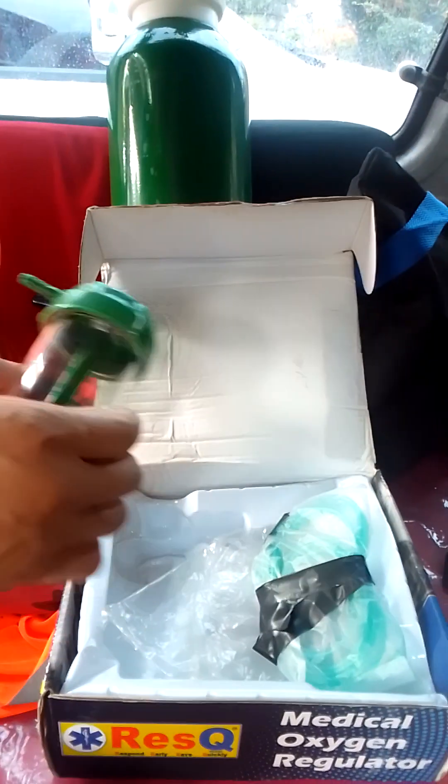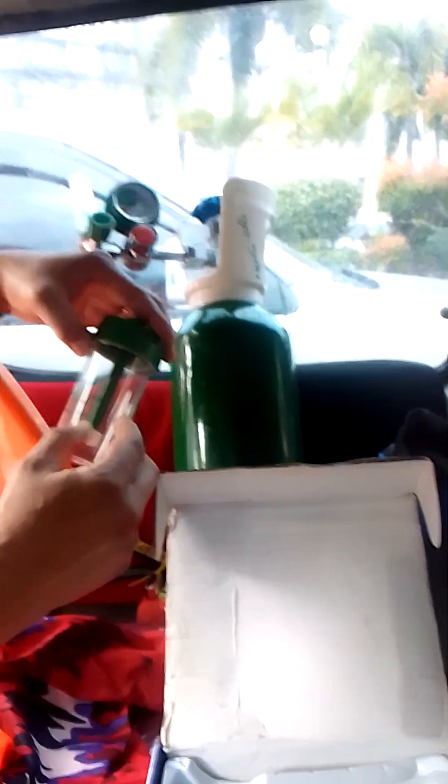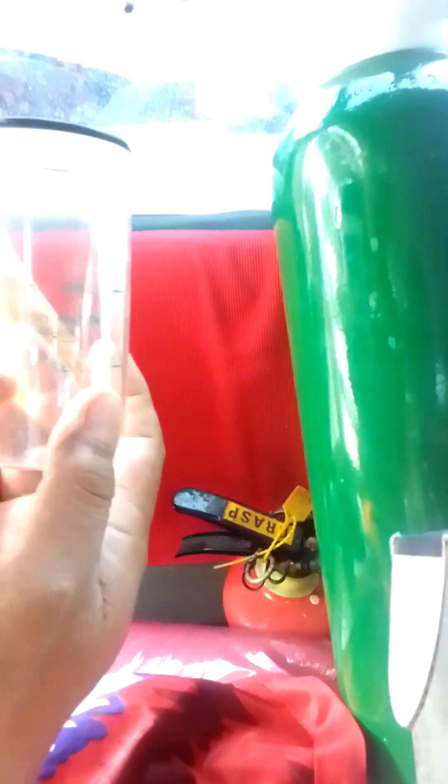First thing is you have water — spring water, not water from the sink. Natural water. Open this baby. Once you open it, you put water here to lower level, middle, or upper. Then close it up.